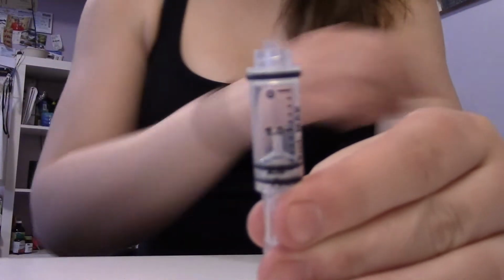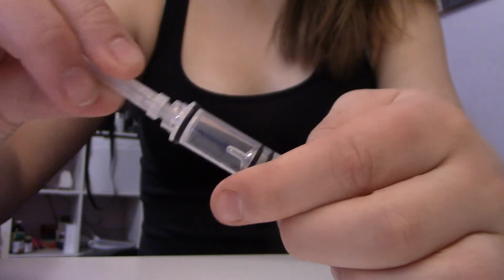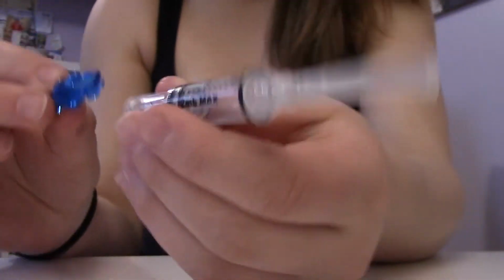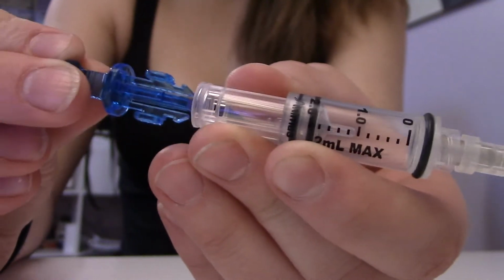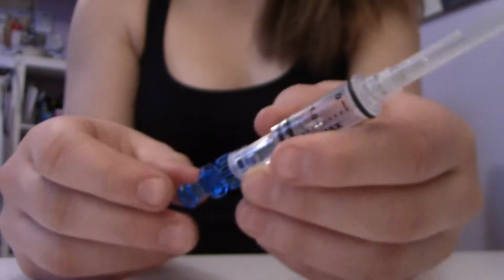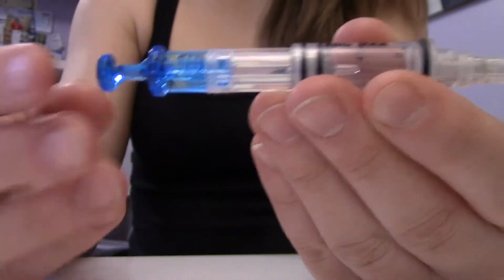Okay, so what you're going to do next is you're going to take that needle part and you're going to put it on top. This is what's going to take the insulin out of the insulin part here. And then you're going to put this nifty little blue thing on the bottom. And that's just going to pop into place. You should hear a little click, but one more time just so you guys can hear it. Pop. Perfect. And then you're just going to push it about 5 or 6 times just to make sure that it doesn't get stuck when you go to draw the insulin out.